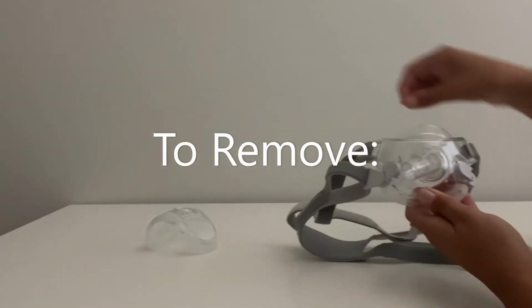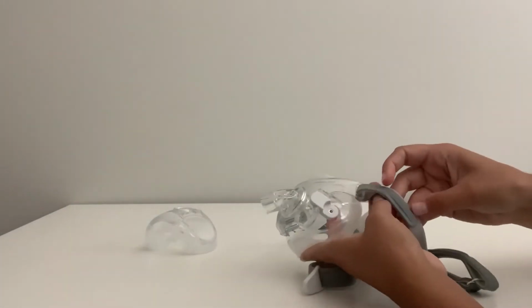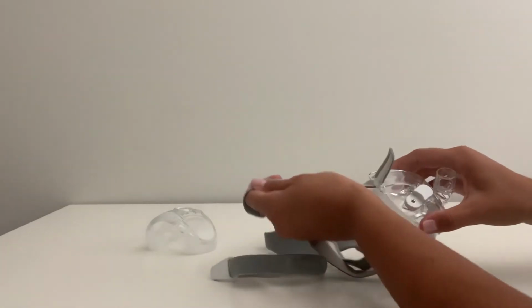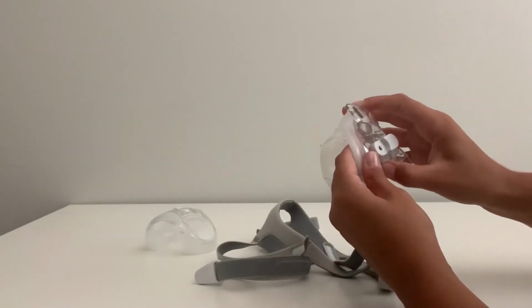To remove this cushion, simply detach the magnetic clips and pull the Velcro straps out of the frame. Then, gently pull apart the frame from the cushion.